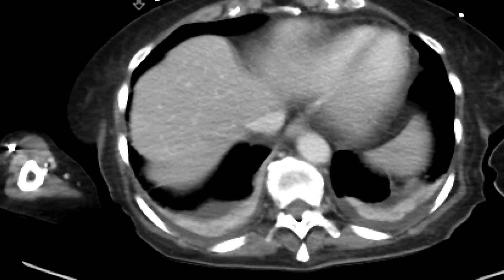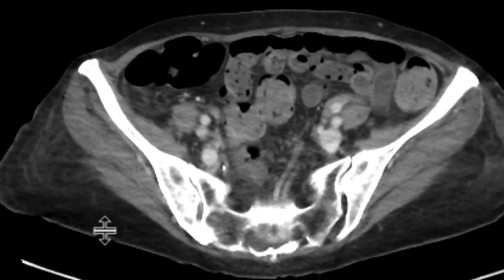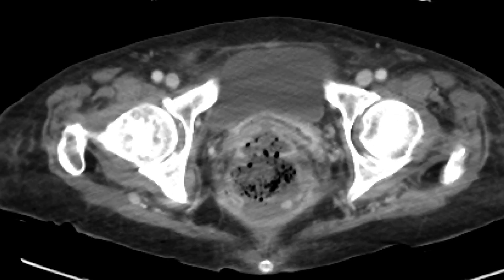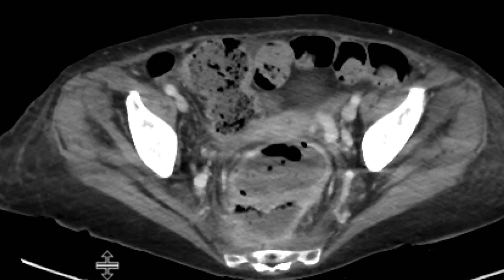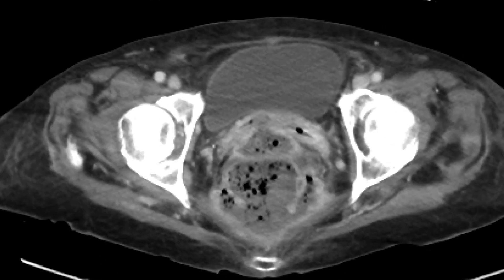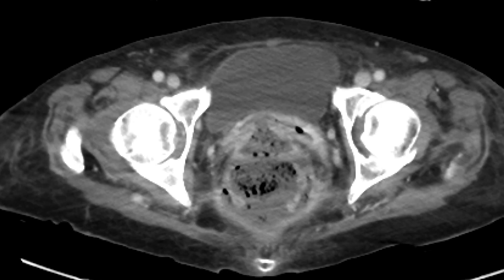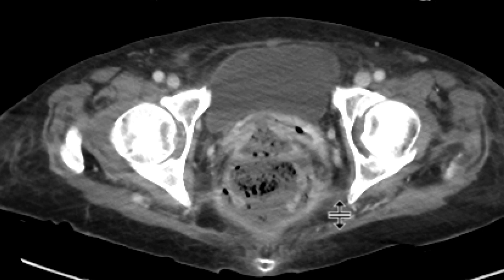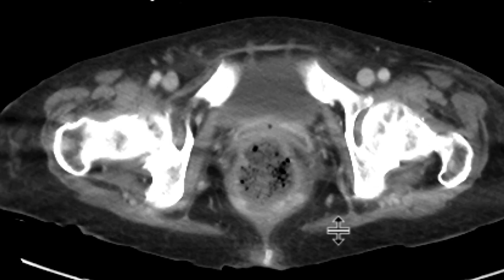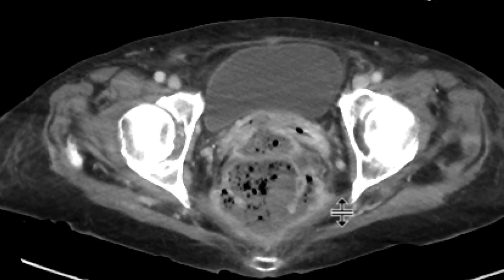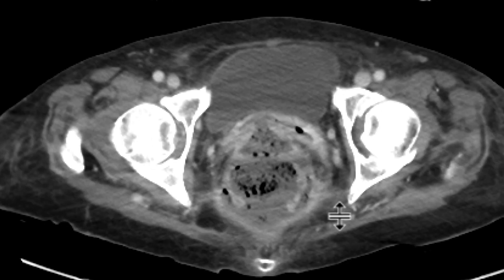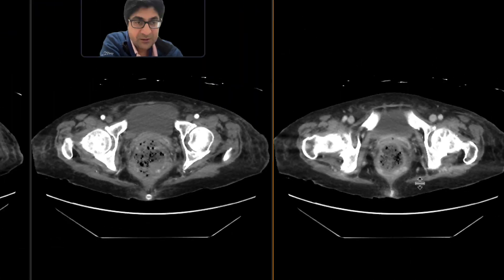As we go to our more delayed phase, we can again appreciate the findings of perforated rectum with all the stool going out posteriorly and that contained posterior collection. But we can also appreciate right around here this communication — this fistula between the rectum and the vagina. You can see the vagina filled with a little bit of fluid, and we can see the foci of gas within it as well. So not only does this patient have a perforated rectum, the patient also has a fistula developed to the vagina.